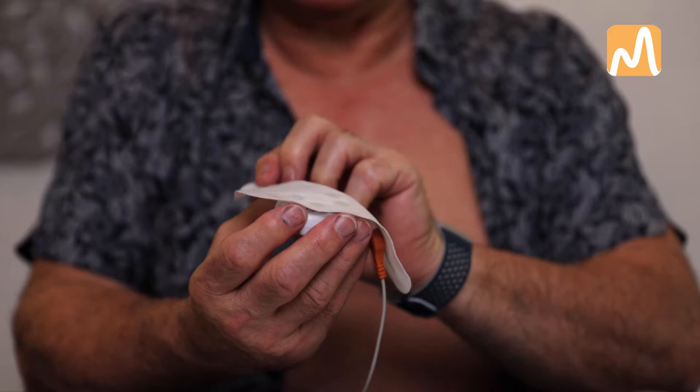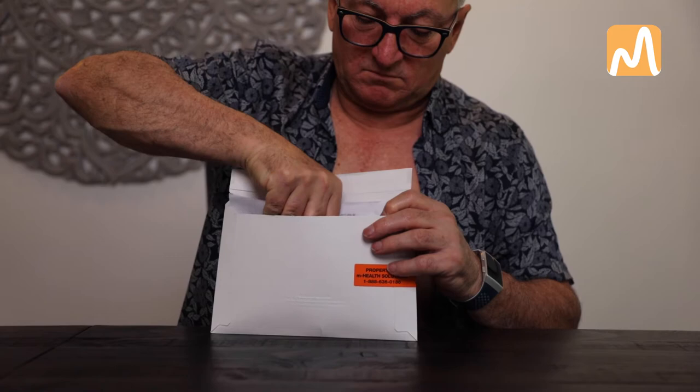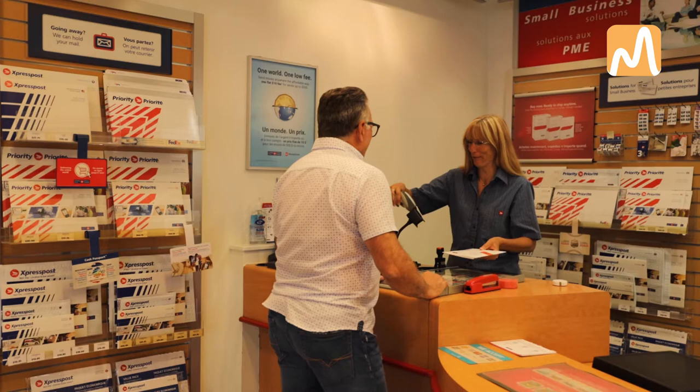Simply fold the patch onto itself, tuck in the lead wire, and slide it in the bubbled pouch provided. Place the bubbled pouch and symptom diary into the prepaid envelope. Seal the envelope and take it to the nearest Canada Post depot where it can be scanned and safely tracked.